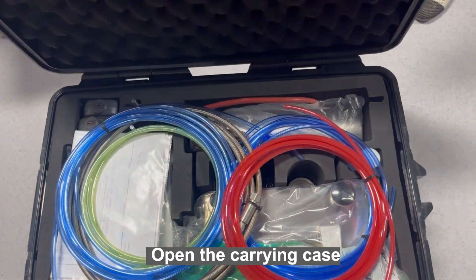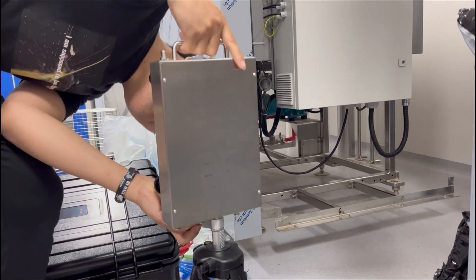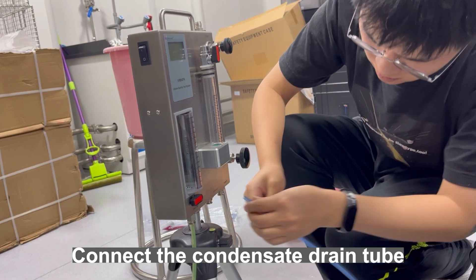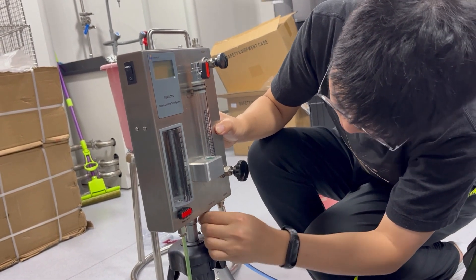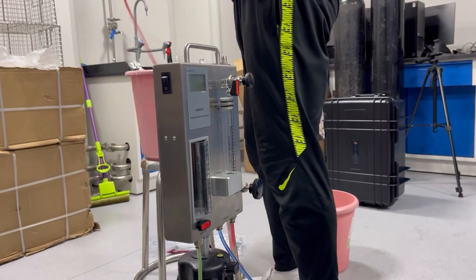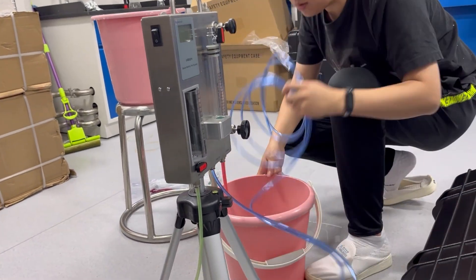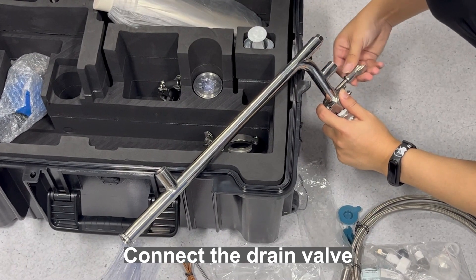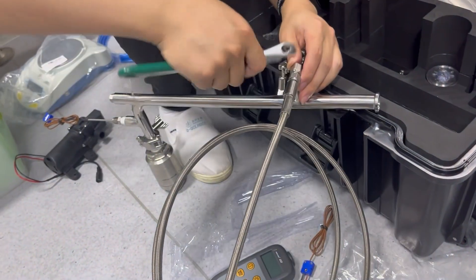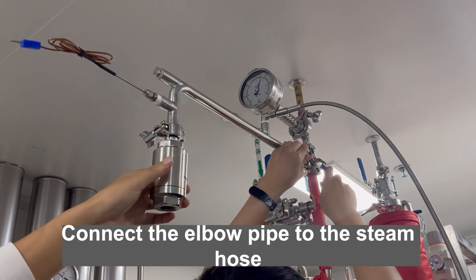Open the carrying case. Install the tripod and the non-condensable gas unit. Connect the condensate drain tube, cooling water drain tube, and cooling water inlet tube. Connect the drain valve. Connect the steam hose. Connect the elbow pipe to the steam hose.